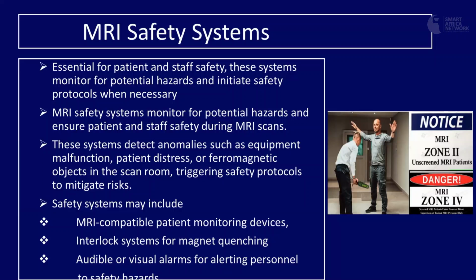Okay, such as cochlear implants, cardiac pacemakers, eye implants. Have you had orthopedic implants within your bones? So these are very important. Some of them are actually MR safe now, but it's important to ask these questions, because he's entering a very high, powerful magnetic field.